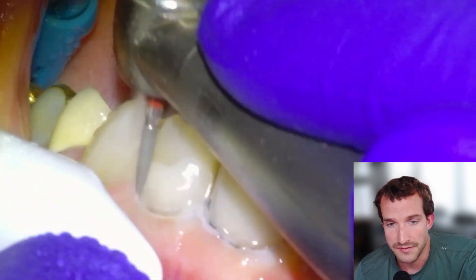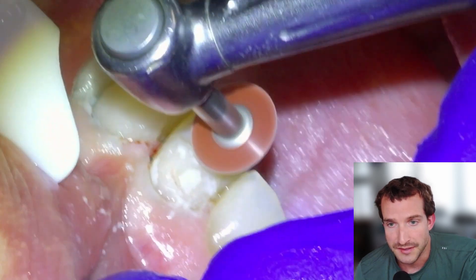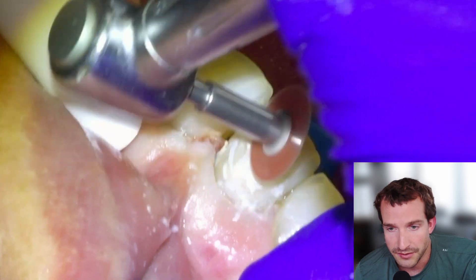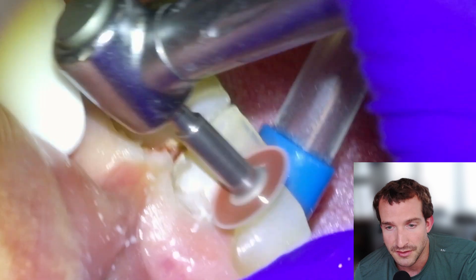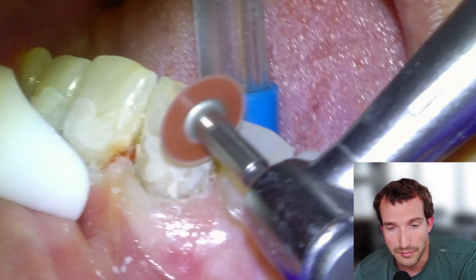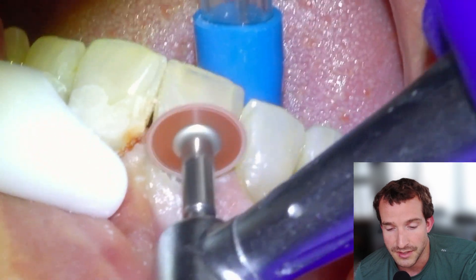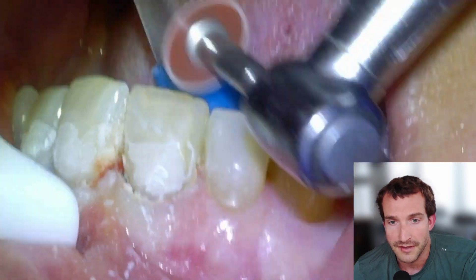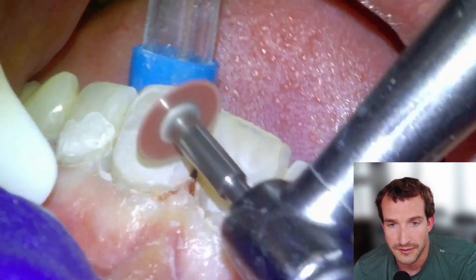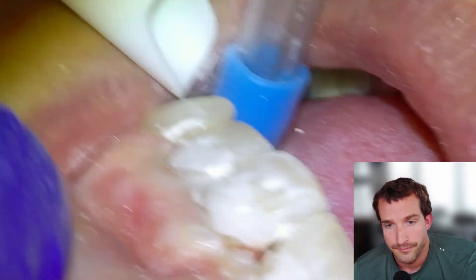We'll use the fine diamond flame on the high speed for most of the trimming with water irrigation, then switch over to a soft flex disc to finish our contouring, trying to get all the way down to the gingival margin. Pressing in from the outside makes a nice natural-looking contour. Of course it turns chalky white when you're adjusting it without the high speed, making it very easy to see the margins of the restoration and the excess material that still needs to be reduced. We'll fast forward through this, using the technique of pressing from outside inward to make a nice round natural-looking contour.